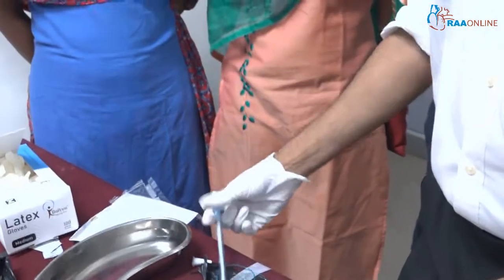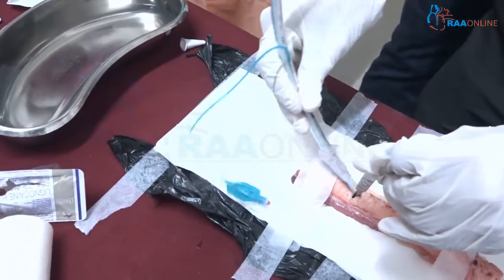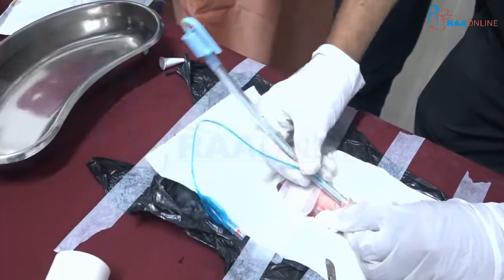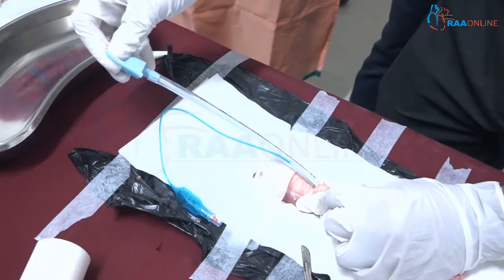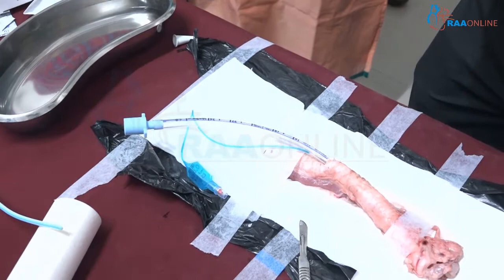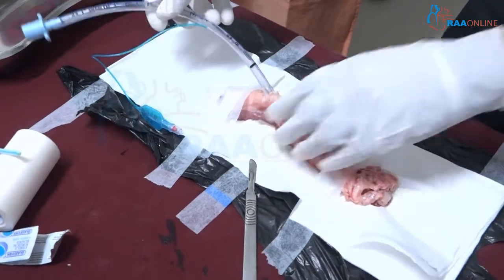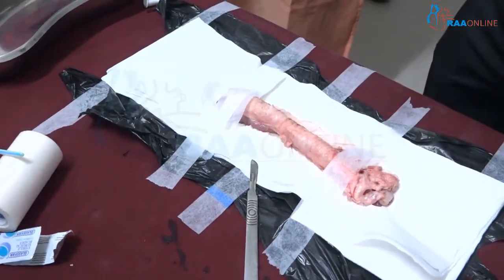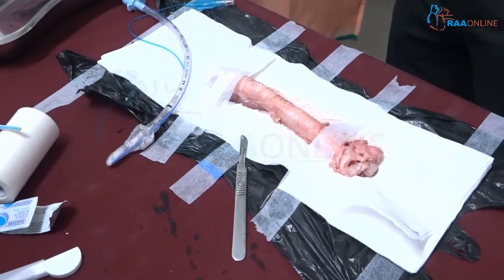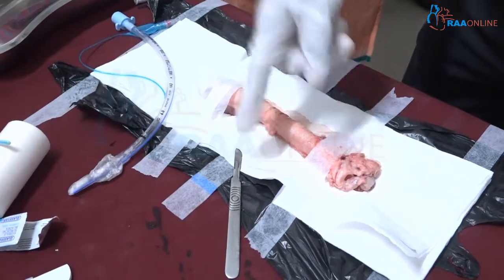Think of it like a bougie — insert the bougie inside. Once it is in, fix it, railroad the endotracheal tube inside over the bougie, then remove the bougie. Inflate the cuff, then check capnography to confirm correct position. The 6mm internal diameter tube is recommended because this is the minimum size through which we can adequately ventilate an adult patient without excessive resistance and also eliminate carbon dioxide.